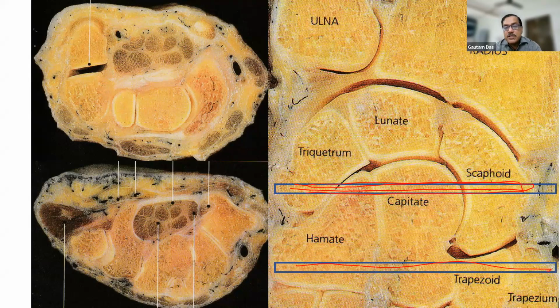So in the base, the lunate is not there. This is one of the very common mistakes I have seen done by many of the fellows. As I told you, lunate is a very superficial bone, prominent. So what we have to do, we have to slide the probe to this side. As soon as the lunate disappears, then only the proximal carpal tunnel will be reached.